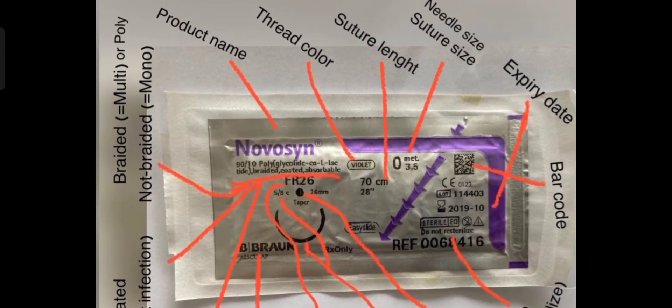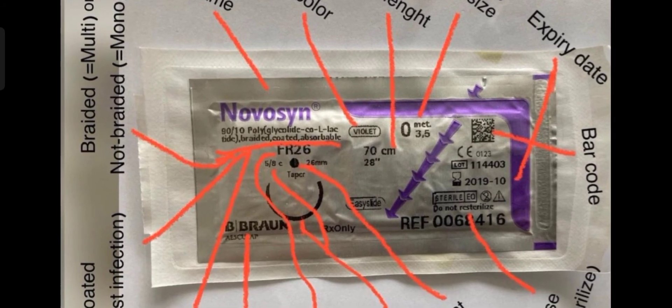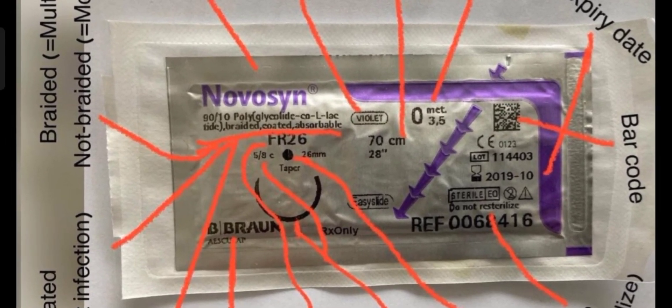There is the word 'braided' written, which means it is multifilament or poly. If it were non-braided, it would be more like Prolene. But this is a braided suture. So we have now covered all the details on the suture packet.